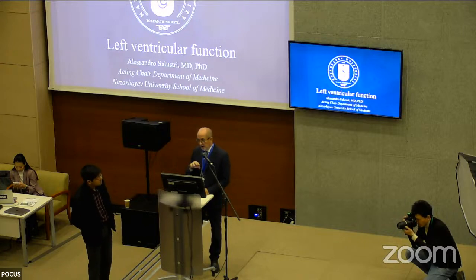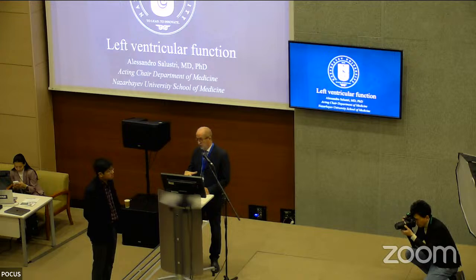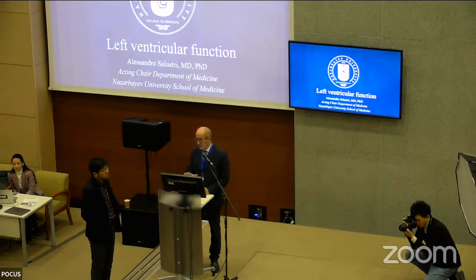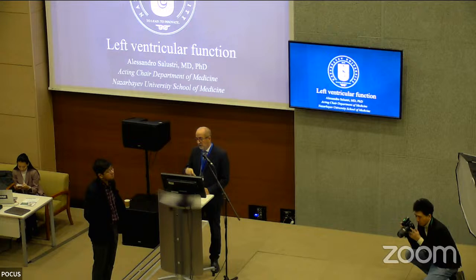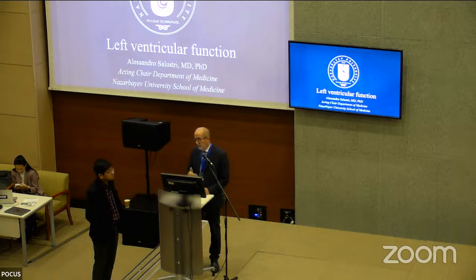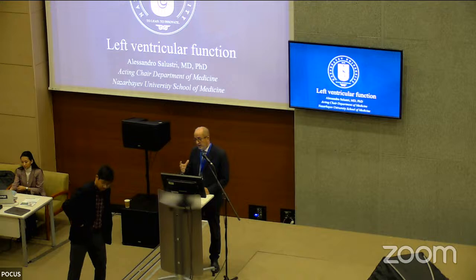In general, both ejection fraction and VTI, they go hand in hand. When the VTI is low, we should expect also an ejection fraction that should be quite low. Sometimes it can happen that the ejection fraction is still normal or just mildly reduced, and the VTI maybe a little bit low. But again, this is maybe because of the load dependence of the stroke volume, and maybe because of drug effect, and also because of the peripheral resistance status. But in general, they go in parallel.